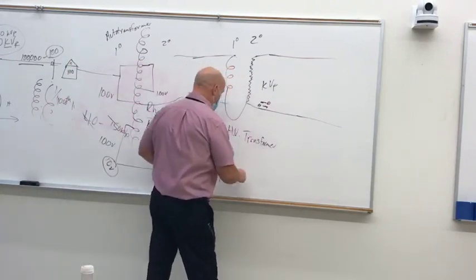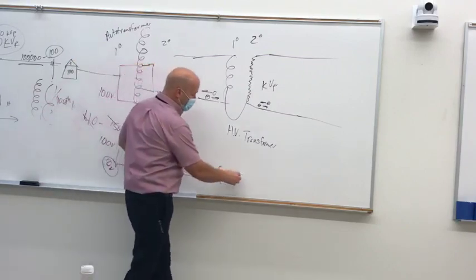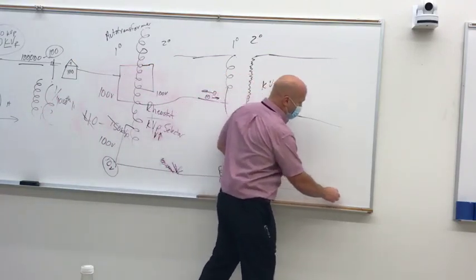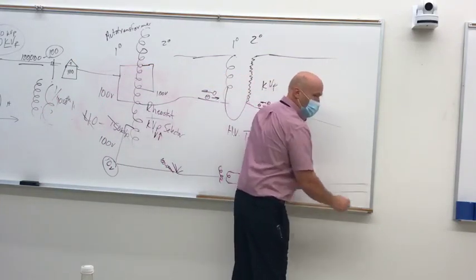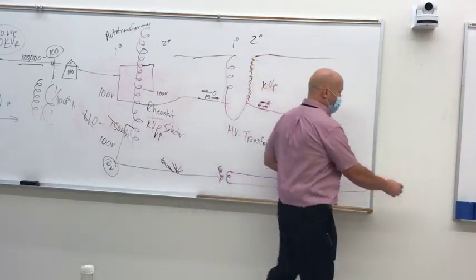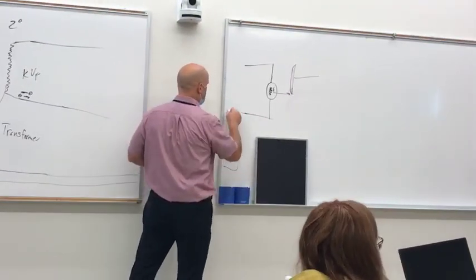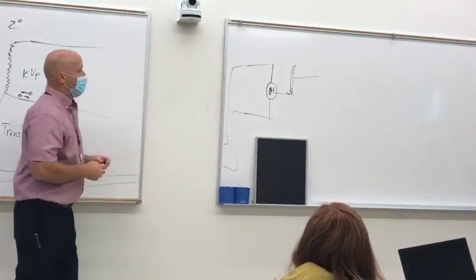So what we're going to have is a filament current. The filament current also plugs into the X-ray tube. Now we need to adjust again. Also goes into the X-ray tube and plugs in to the filament as well.